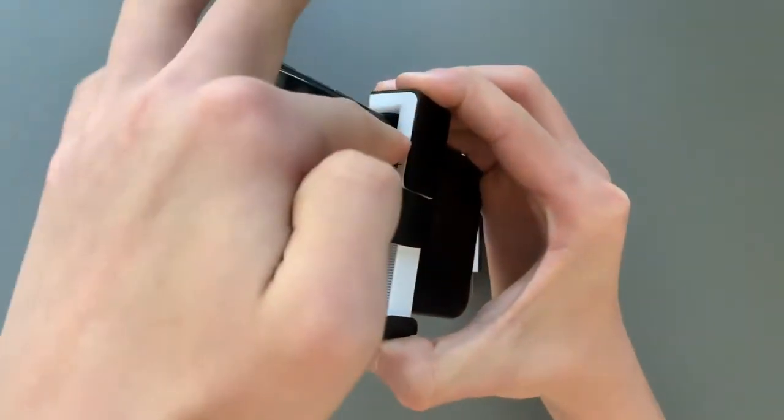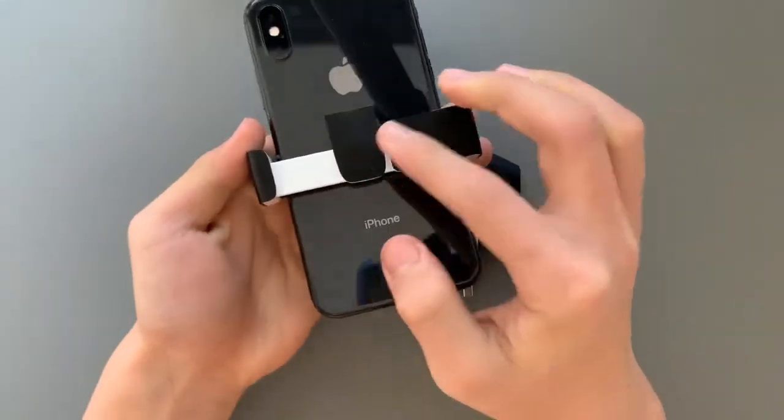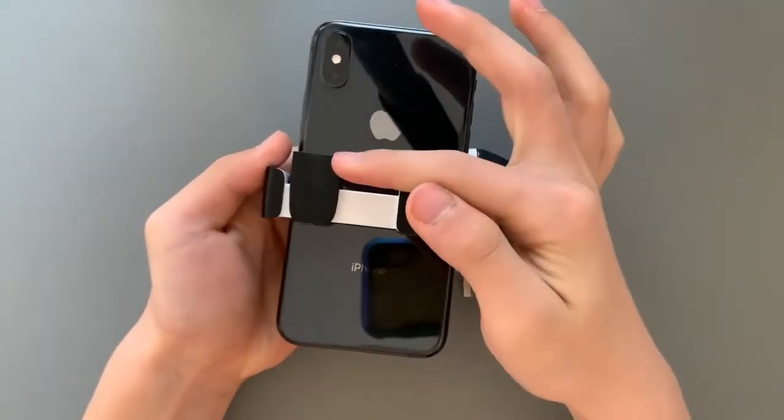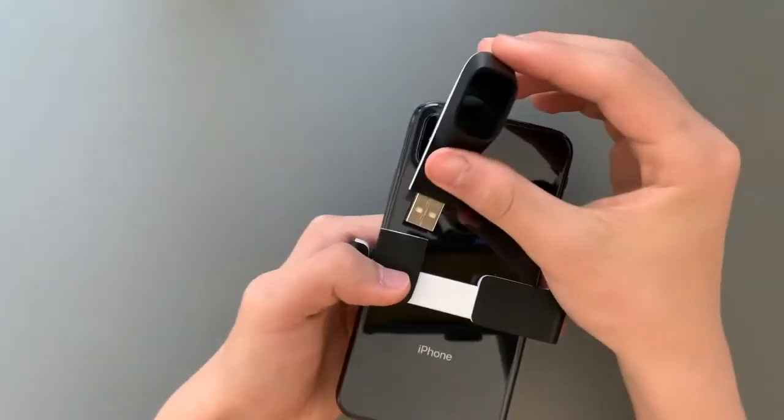Place its universal mount on the back of your smartphone, squeeze it tight, then activate the slide lock. Position the DermLight mount so that it is horizontally aligned with your smartphone's camera, then attach the DermLight dermatoscope.